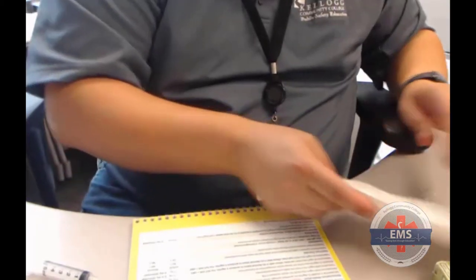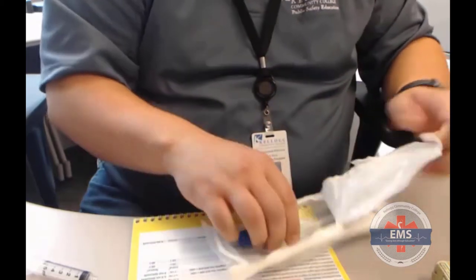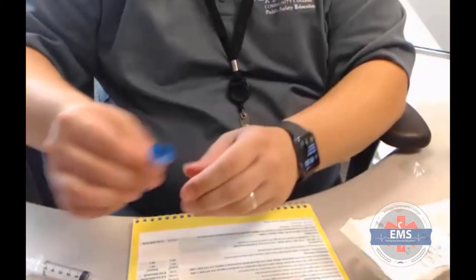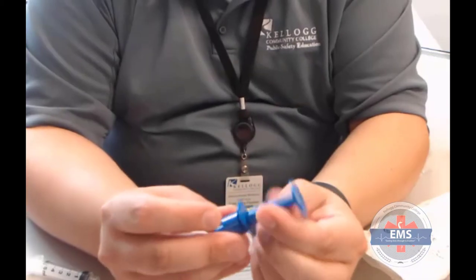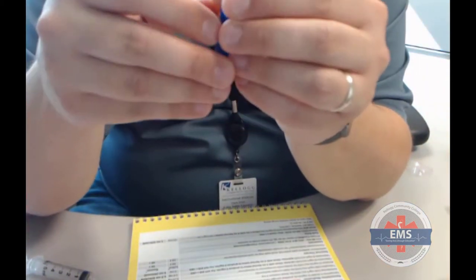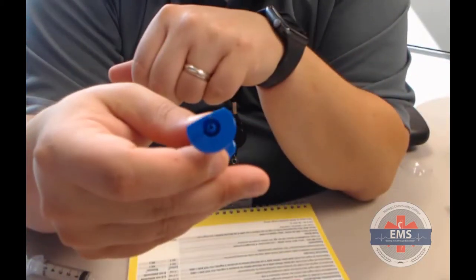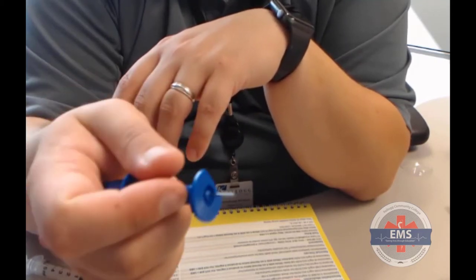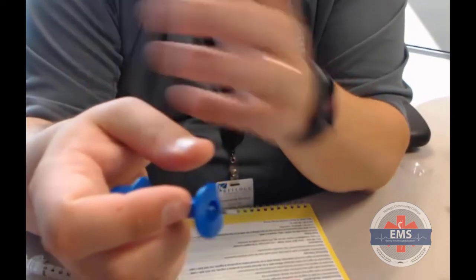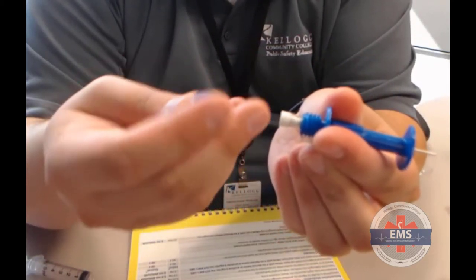If we take a look at the IO, the manual IO, because sometimes we get a little confused on these, sharps out. Here again you can see that I've got my example. This is an Illinois needle. You can see right away that the needle here is quite small. It's relatively easy for these to be bent, especially if we're using them for an adult. So they're good tools, but they're not as reliable as the EZ-IO. But that's okay. I can take this apart a little bit to show you some of the pieces.